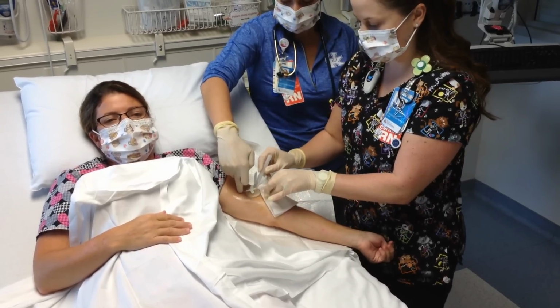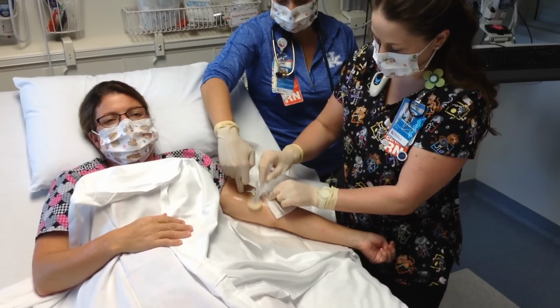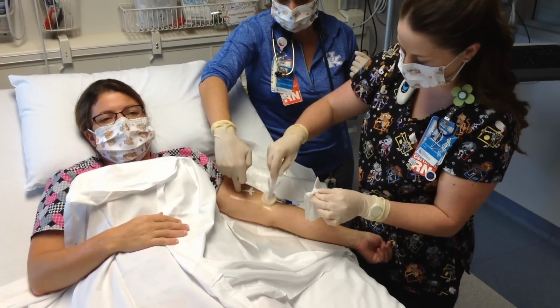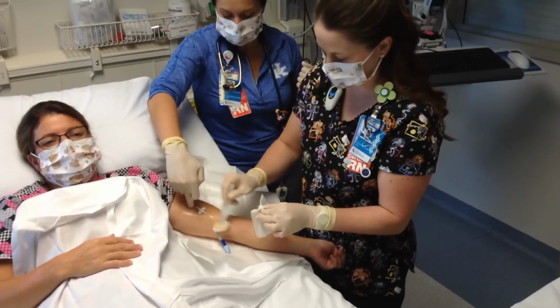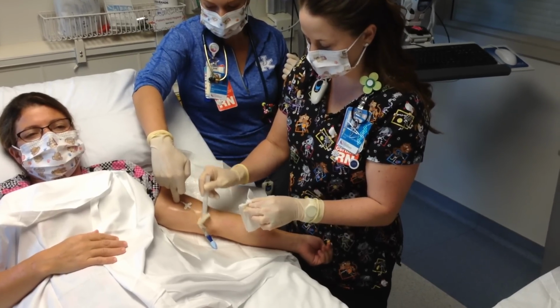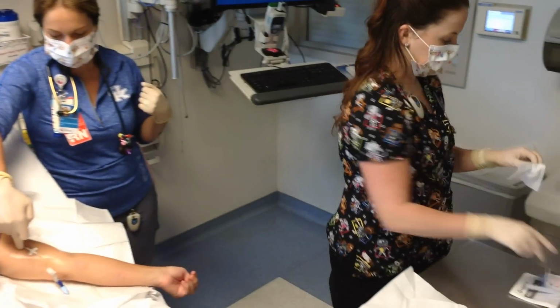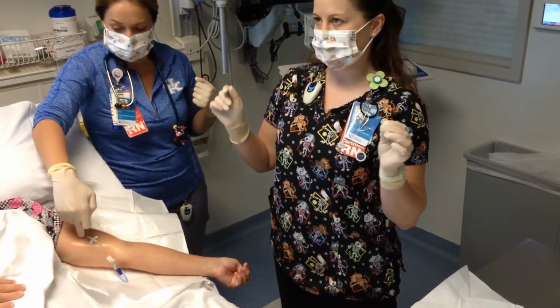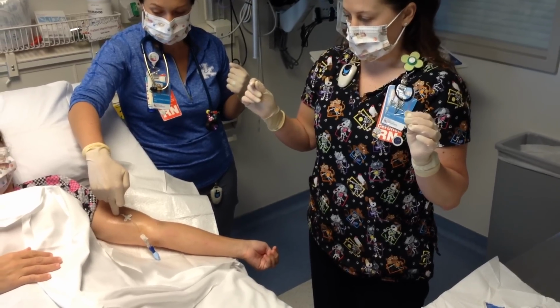You want to make sure you get under your wings as well. And if you notice any areas of skin breakdown where your securement device was, or you need to reposition the wings so that you let an area rest, you should do so. Also clean the length of your catheter. Anything that's going to be under your dressing needs to be cleaned. Then we will do a 30-second dry. And make sure you're watching the clock, because 30 seconds is a lot longer than you think it is in your head, so watch the clock.